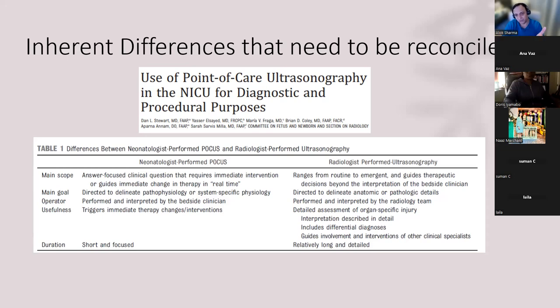Well, if I can do a lung ultrasound, which shows the maximum pocket is actually in the sixth space, and the liver is well below that, and I want to go into the posterior axillary line, I can mark that out. And that's actually the point at which I want to go. So it's something that is going to aid my practice, that I can learn how to do. From my perspective, it makes things much safer. And it might trigger safety as well as immediate therapy, which is the right thing for that particular baby.